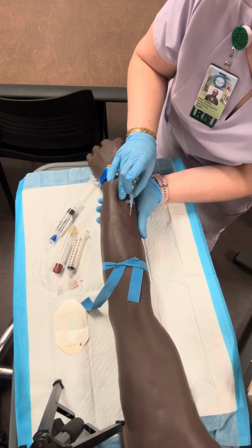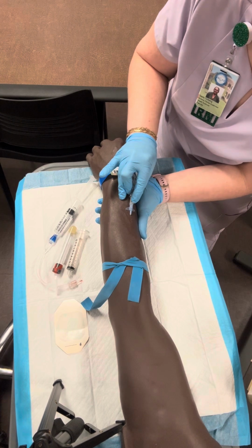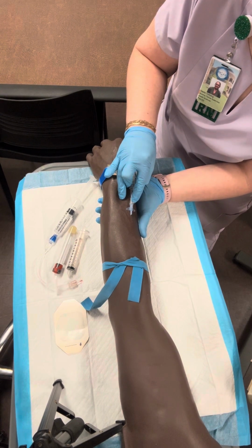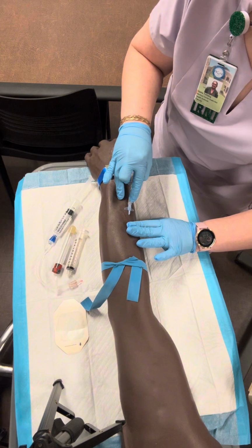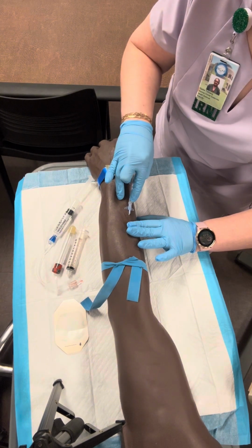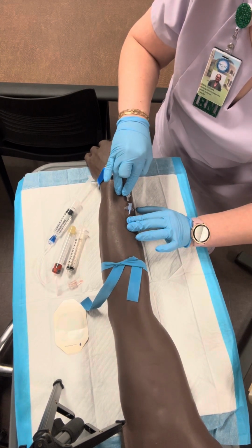All right, nice and slow. And I'm going to take my first finger, and notice how the rest of my fingers are not moving, just my first finger all the way up to that hub. Okay, now the rest of my hand is going to pull back until almost hearing that click. My non-dominant hand is coming up here to hold pressure. That click just occurred. And while I'm pulling away, it's kind of wanting to come with me. So I'm going to hold it, but really I never let go of pressure.